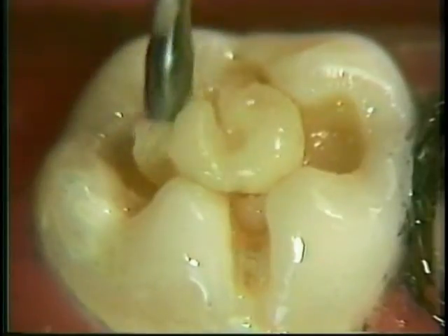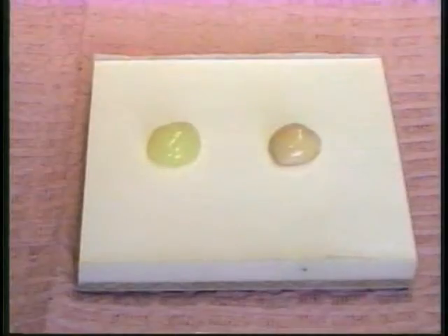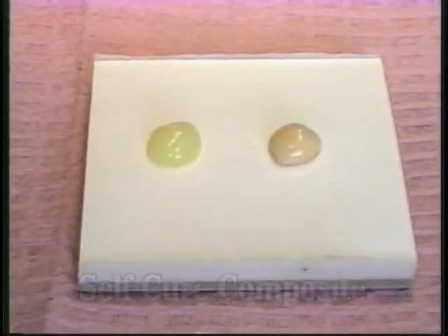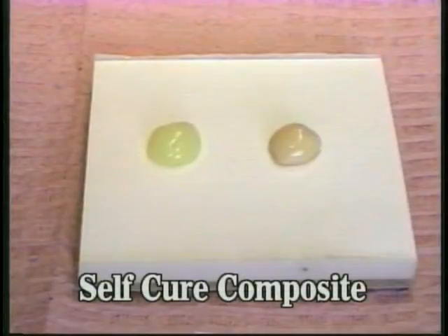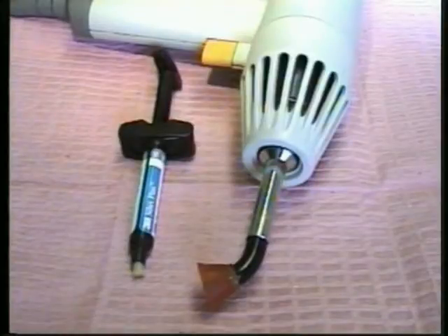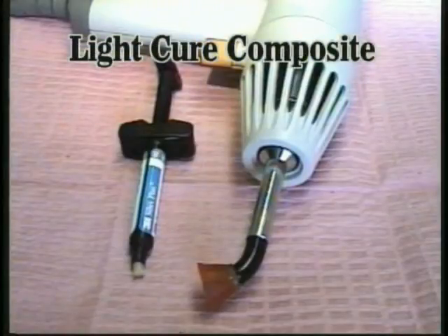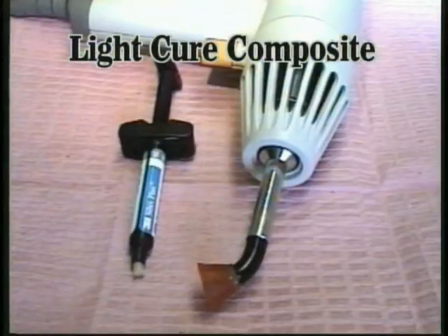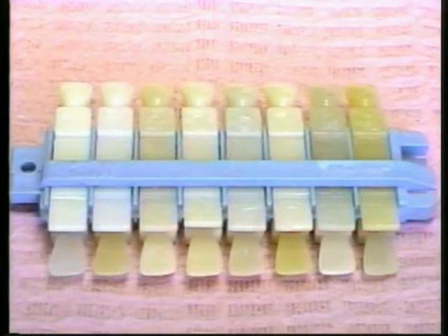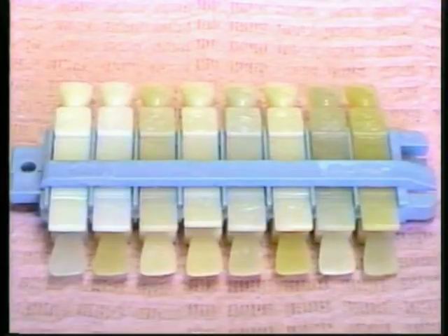The other major restorative material is composite resin. Composite resins are available in a two-part system which self-cure, hardening in three to five minutes after being mixed together. Composites are also available which light cure — these harden by an ultraviolet light in 30 to 60 seconds. The light cure composites are extremely fast and convenient. Composites are available in many shades, making it possible to place restorations which are practically invisible.